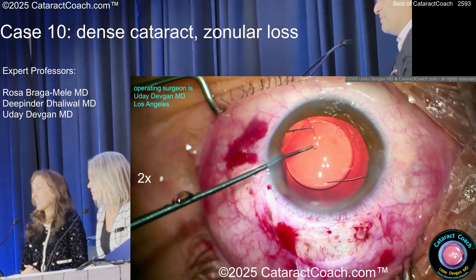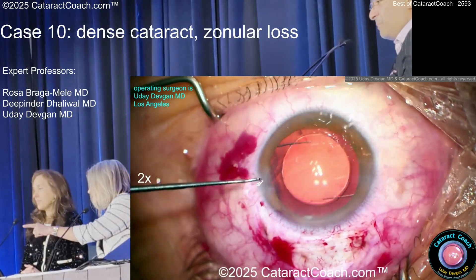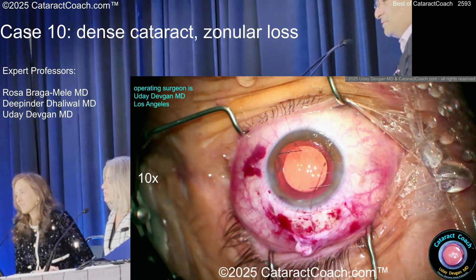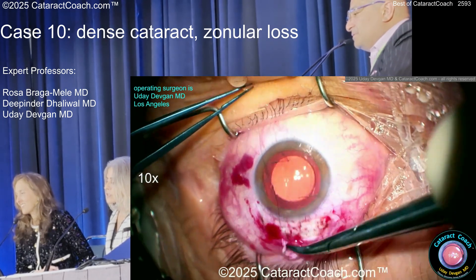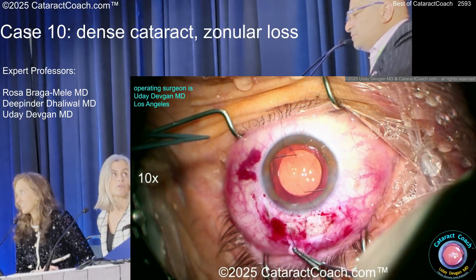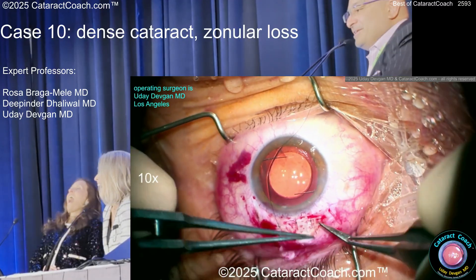It's sometimes hard to get a five-and-a-half rhexis, especially if the bag is fibrotic. That's exactly why I didn't want the trypan on too long — it makes the capsule more fragile. I got a little bit of optic capture through about a five-and-a-half to six millimeter rhexis. I'm old-fashioned — even though the incision seals, I'm going to suture up with 10-0 nylon. Why not use Vicryl so it dissolves? I don't know — I just do 10-0 nylon.